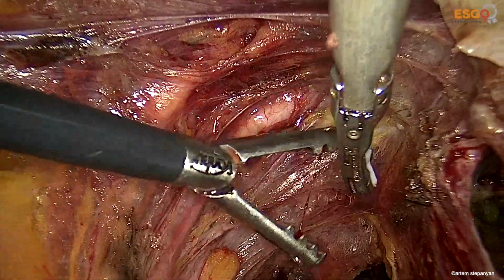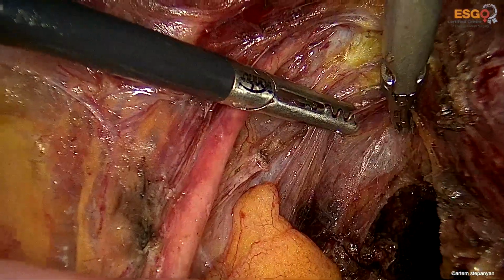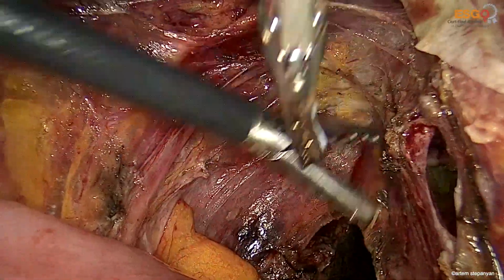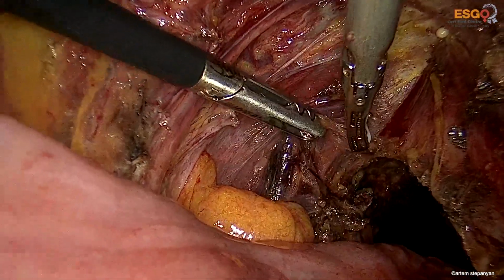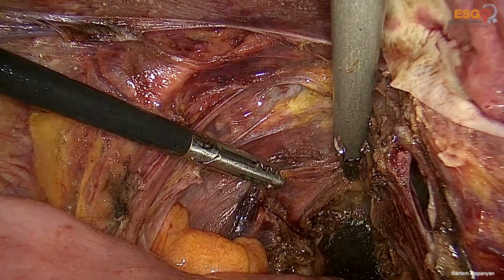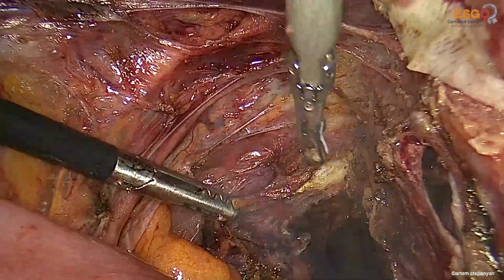At the same time, detaching the peritoneum from the posterior wall of the uterine cervix, and I would say paracervix.